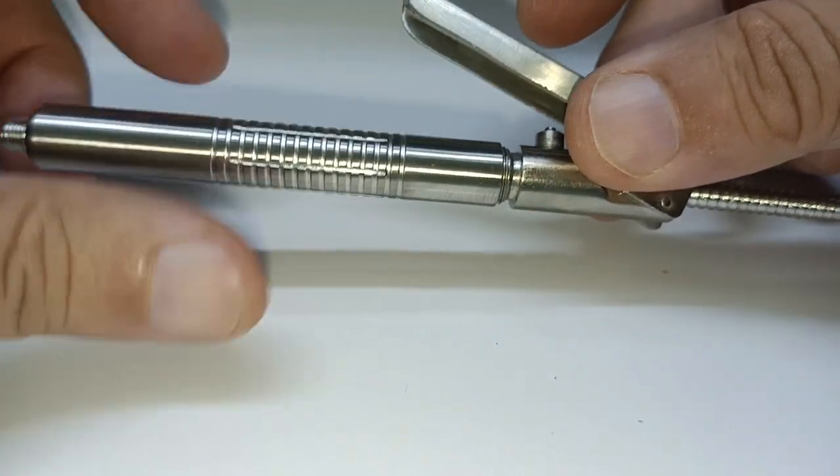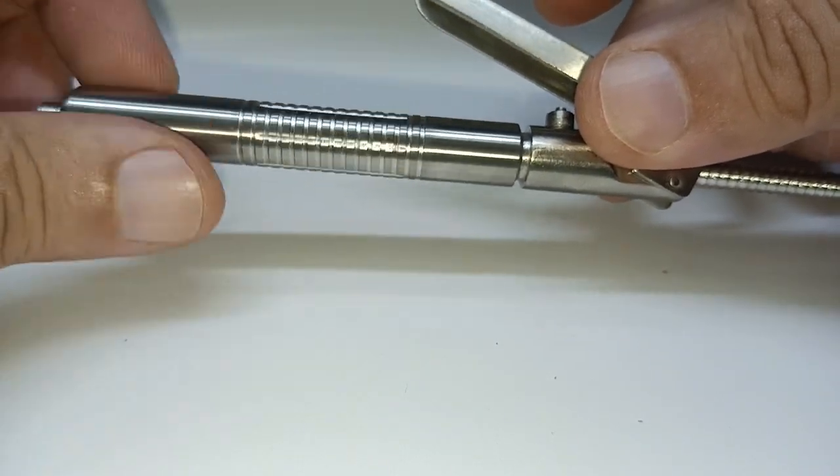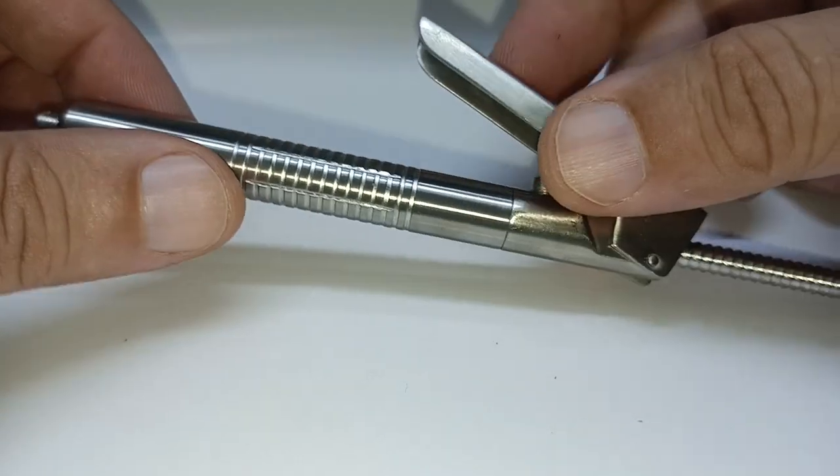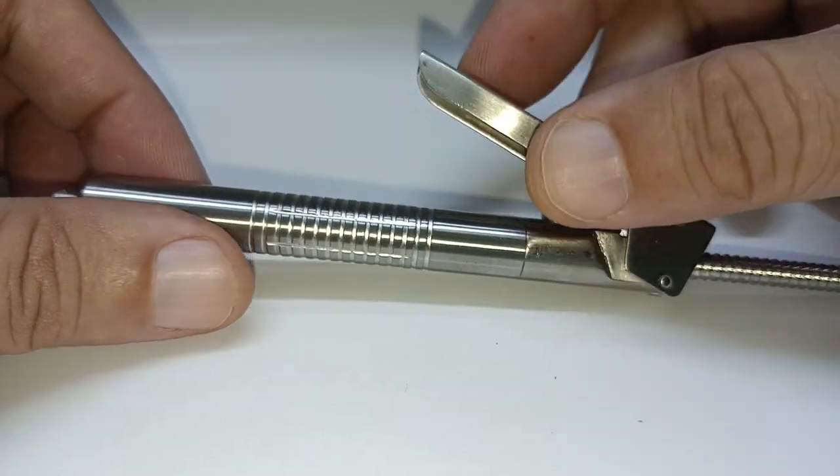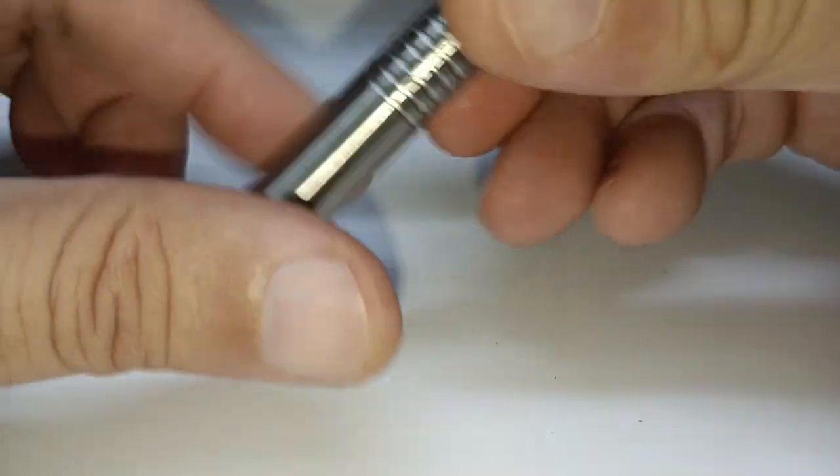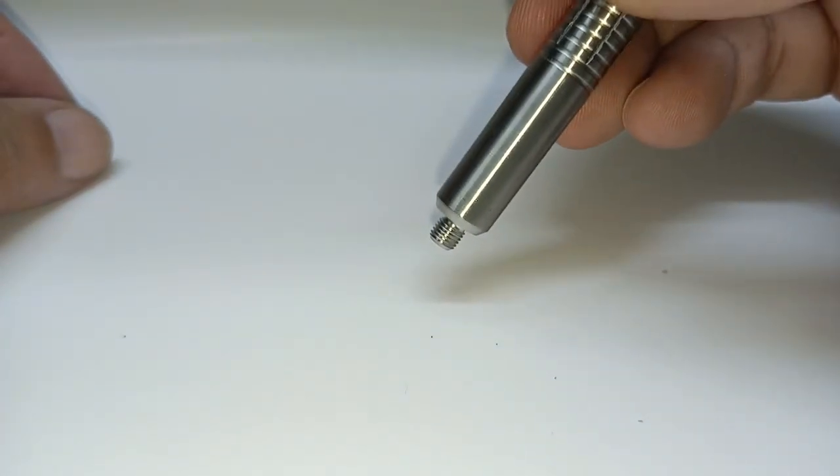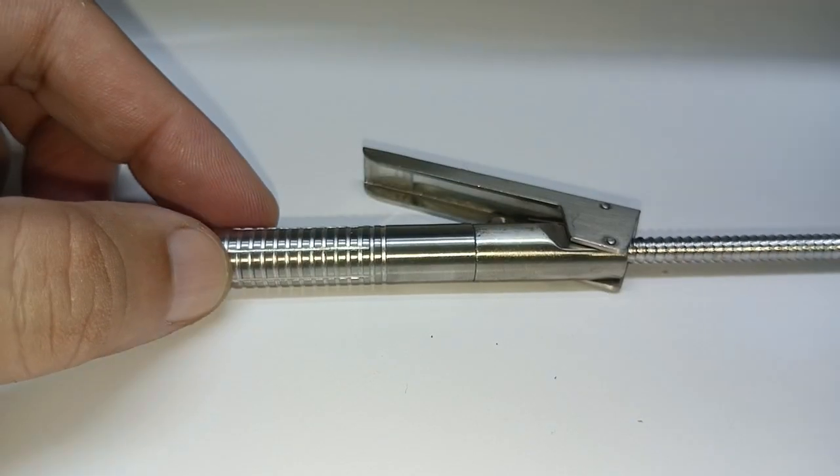In certain cases we have talked about that you would need to give the anesthetic intrapulpally. In those instances also you can use the same ligmaject, and you should be able to deliver the anesthetic holding it nicely like this, straight into the pulp chamber if you have modified the needle. Hope that helps.